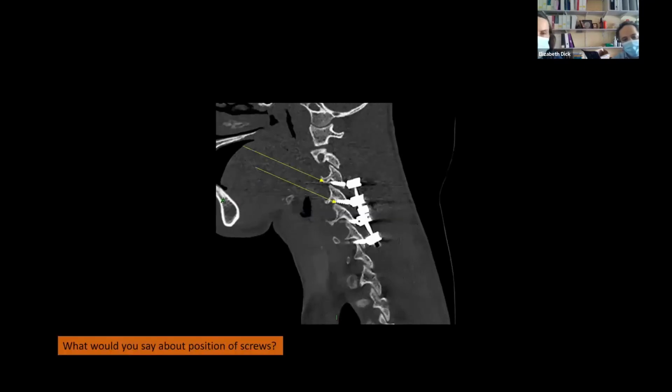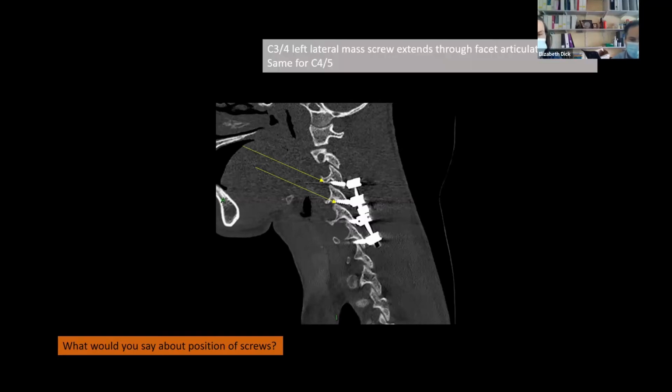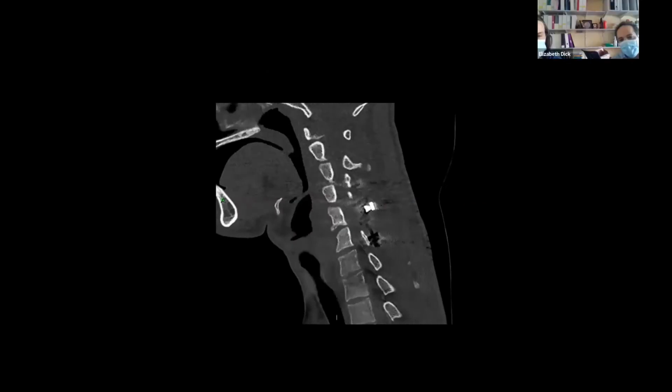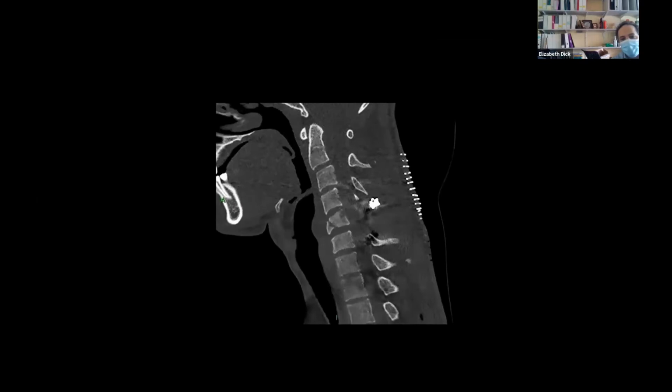And I wonder, as we're running through, if anyone wants to comment on what they think is going on in terms of the position of the screws. So we've got C1, 2, 3, 4, 5, 6. Don't worry about mentioning which levels, I know that's a bit tricky. But what do you think about the position of the screws? Are they within the lateral masses, or are they elsewhere? Feel free to pipe up or to shout, or put it in the chat.